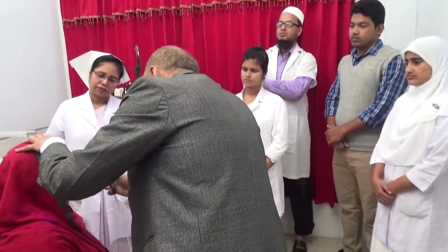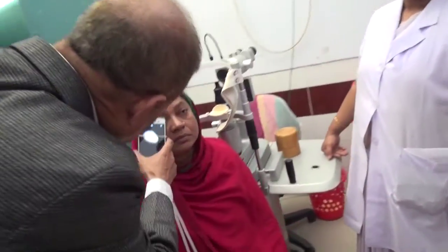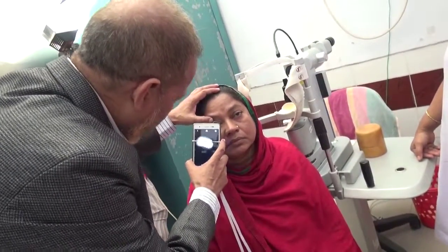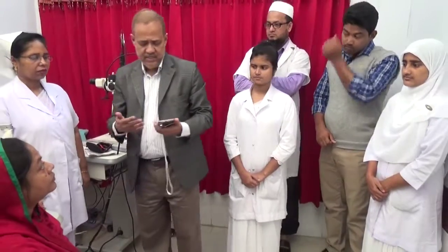For the right eye, I will just take the photograph of the retina, and in this way we can document the original photograph to determine whether it is diabetic retinopathy or not.